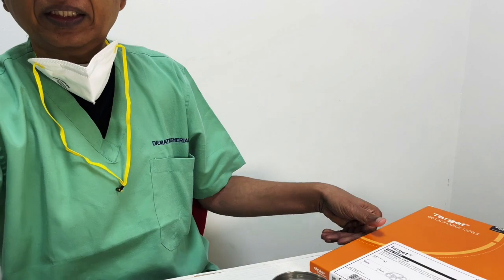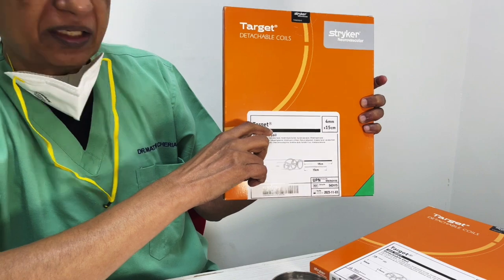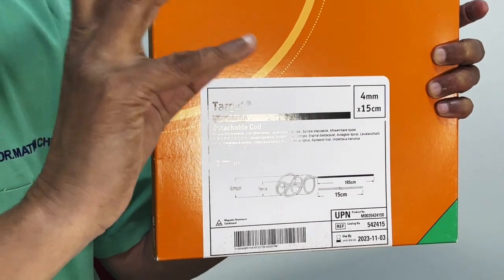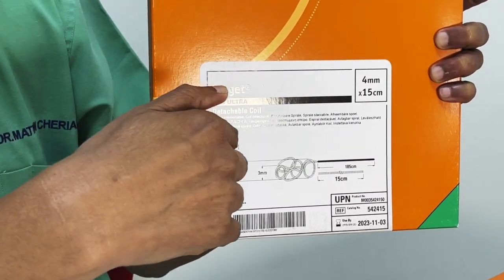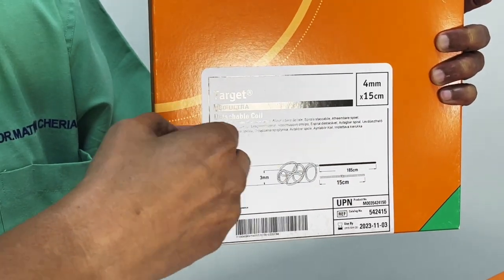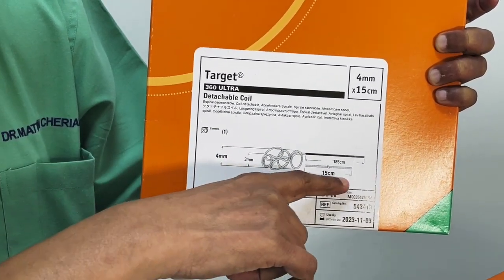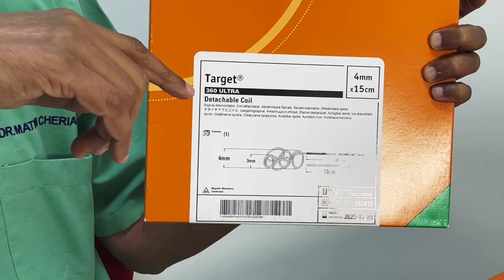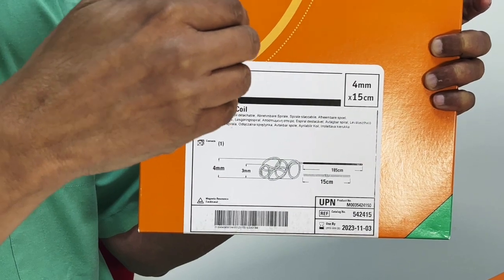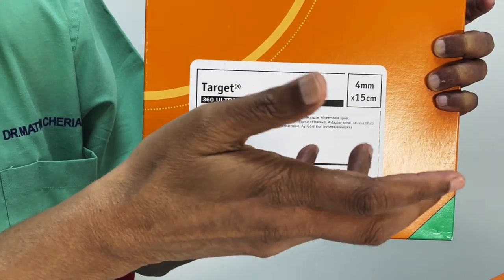On the other hand, here you've got a coil which says ultra on the top. That means it's an ultra soft coil. Now you understand what it means by ultra soft? The pressure required to make the coil fold or break is less, so it's safer. Obviously, when you work in a ruptured aneurysm, you would not want to exert more pressure. It's 4 in diameter and 15 centimeters in length. So this is a 4-15 coil, and you would use it in an aneurysm which is more than 4, say a 6 by 4 aneurysm. Then you can use a 4, and the length would depend on how much space you think is there.